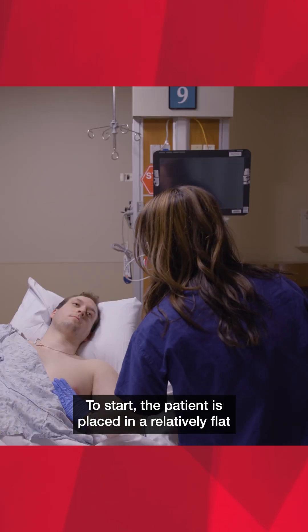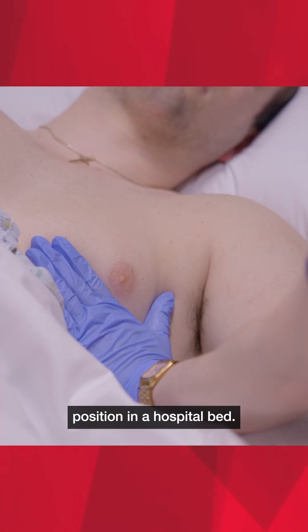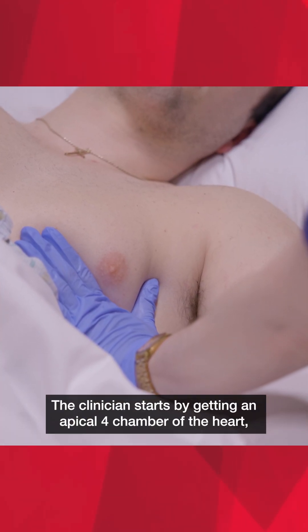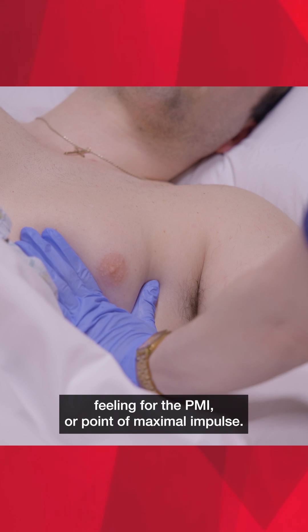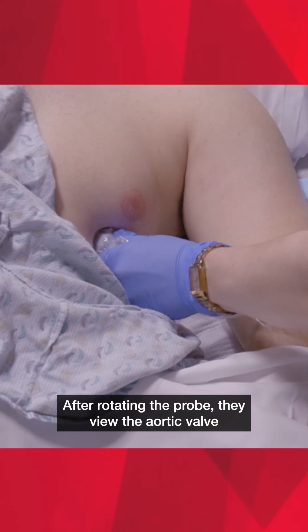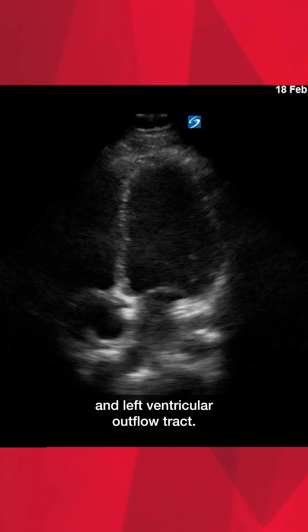To start, the patient is placed in a relatively flat position in a hospital bed. The clinician starts by getting an apical 4-chamber view of the heart, feeling for the PMI, or point of maximal impulse. After rotating the probe, they view the aortic valve and left ventricular outflow tract.